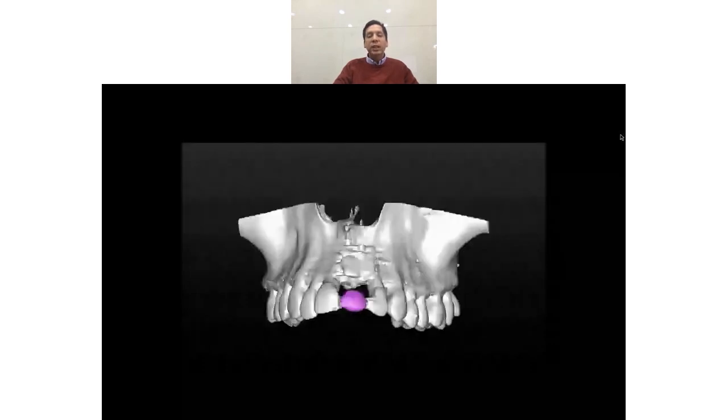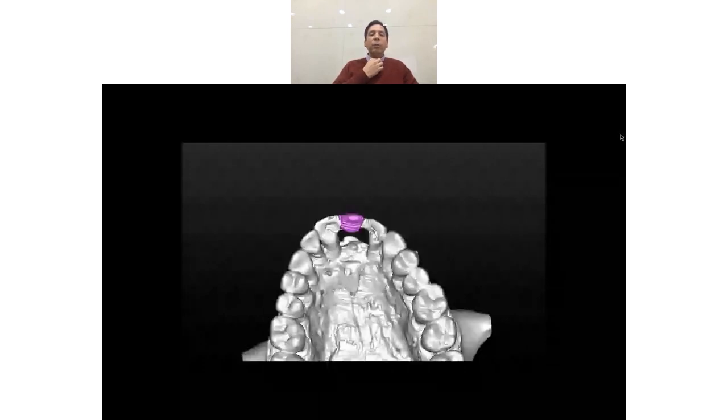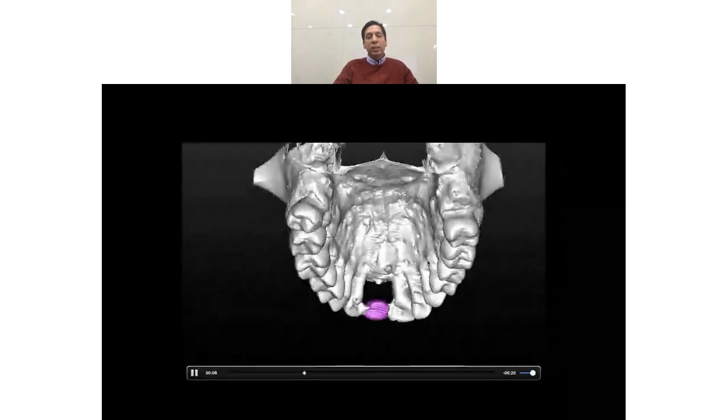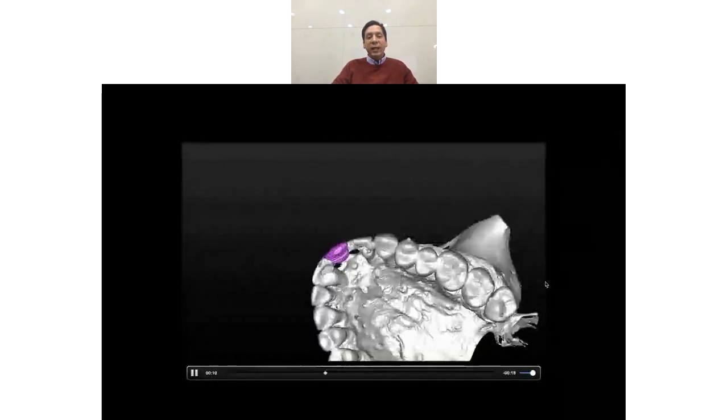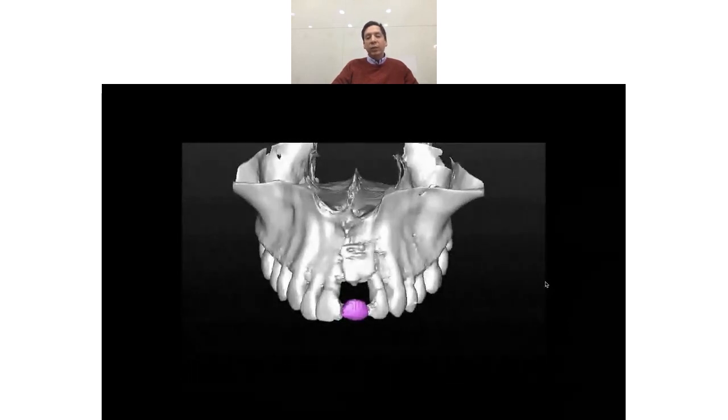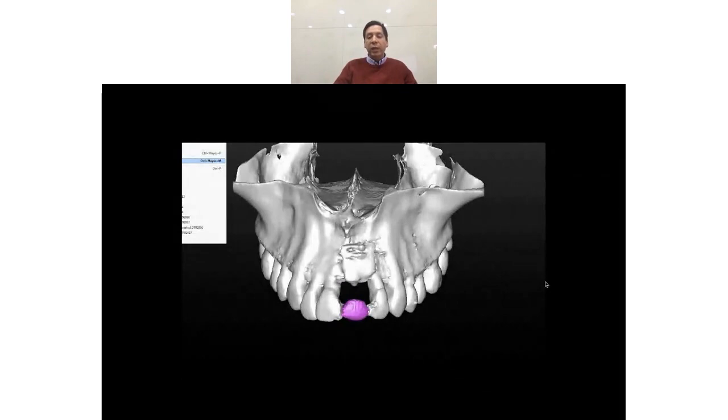And now we will see the CBCT. In the CBCT, what I like to see best is the palatal block here. The palatal block, you can see it here. It's sealing totally the palatal aspect of the bone defect. So we have a perfect coffin in there.